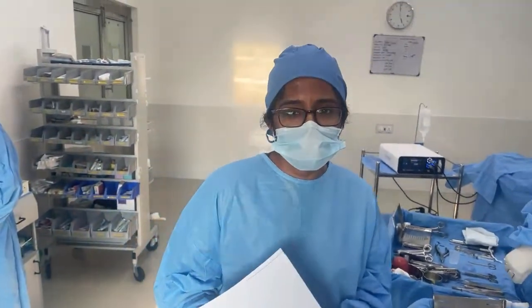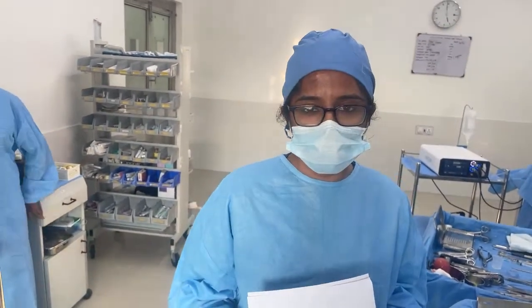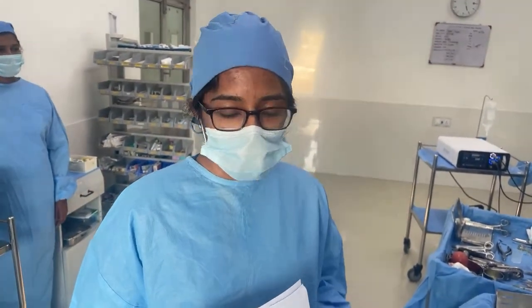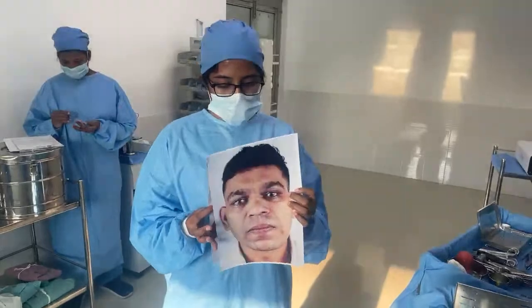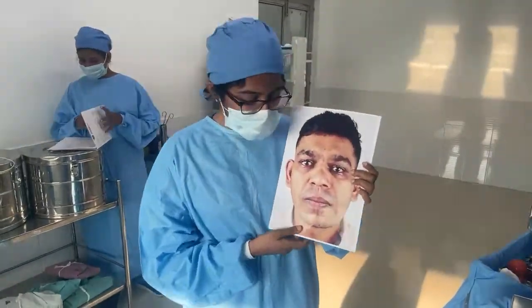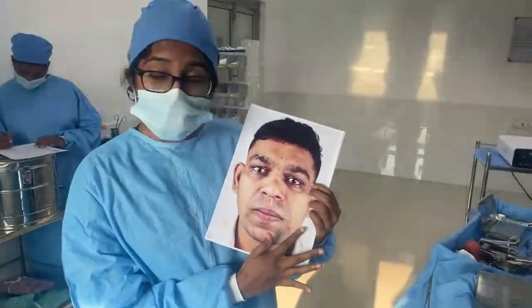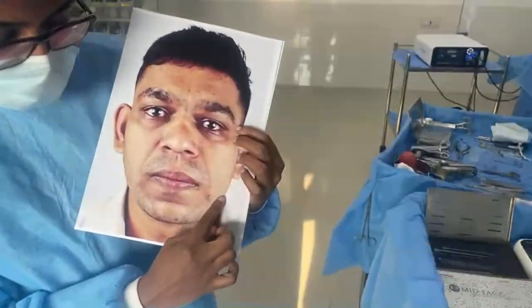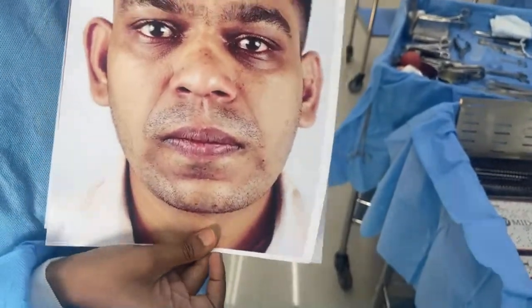Alright, so as you all heard, this is a facial asymmetry correction procedure being performed by Dr. Richardson, along with a genioplasty. Now let me show you the clinical pictures of this patient. This is the frontal view. This patient came to us complaining that both his left and right sides are not equal. You see this side is longer than the other, and he complains of a receded chin.